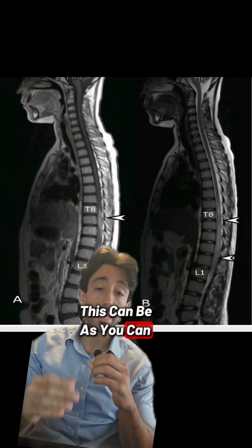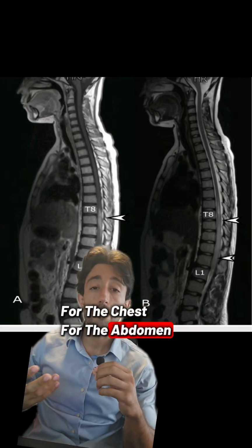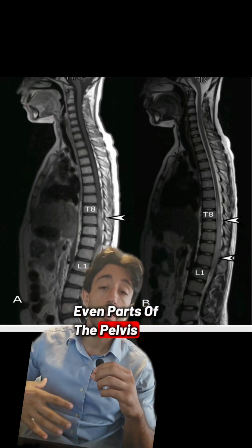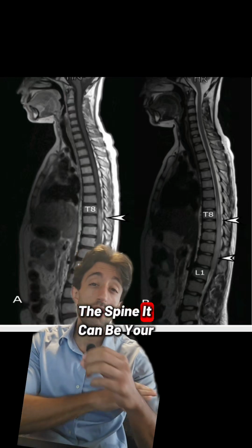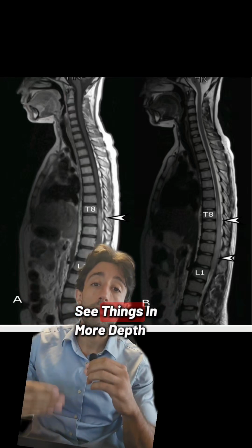This can be, as you can see here, in the spine. It can be for the heart, for the chest, for the abdomen. It can be even parts of the pelvis. It can be other parts of the spine. It can be your arm. It could be your leg. Any different area where they want to see things in more depth.